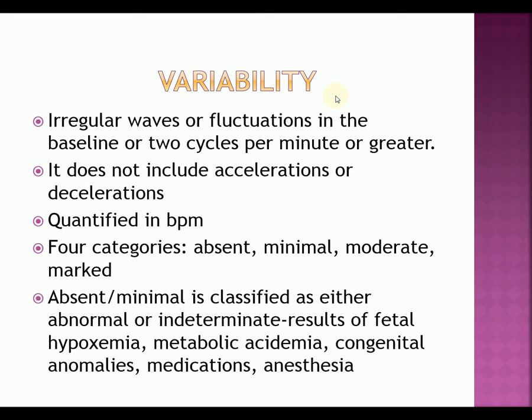There's an example of fetal tachycardia. But the sinusoidal pattern usually is associated with maybe infections such as chorioamnionitis, fetal sepsis, and sometimes with administration of drugs. Stadol especially can cause a sinusoidal pattern.